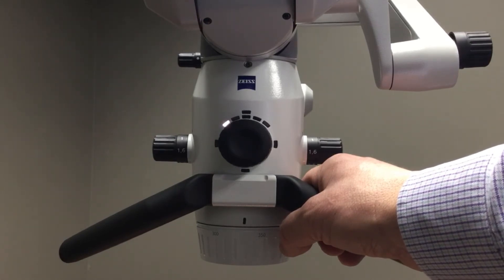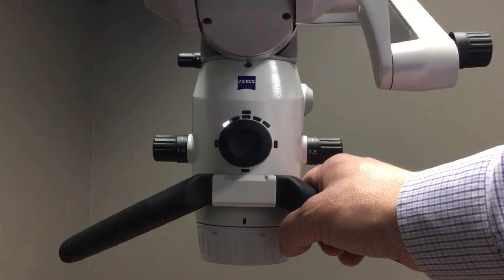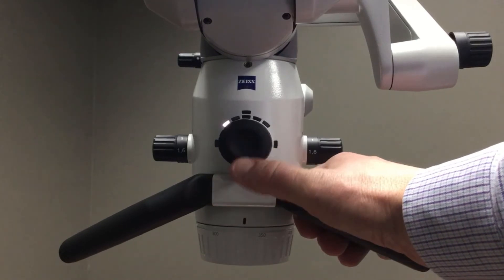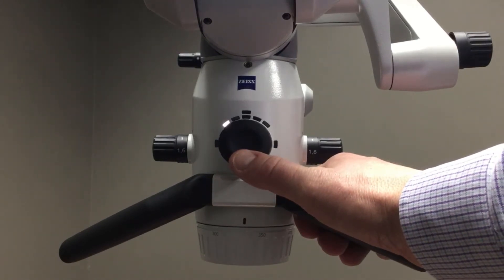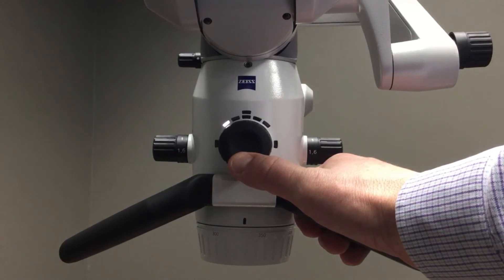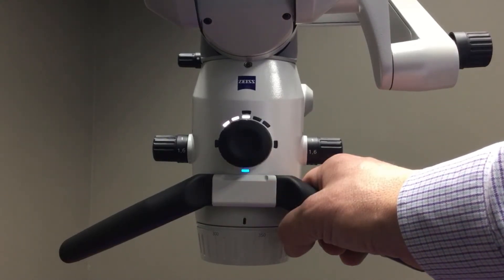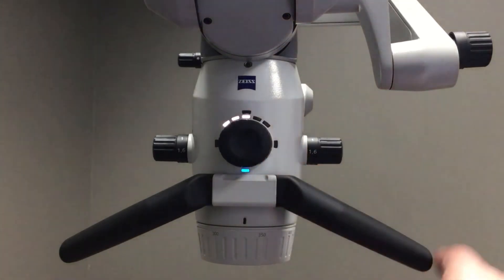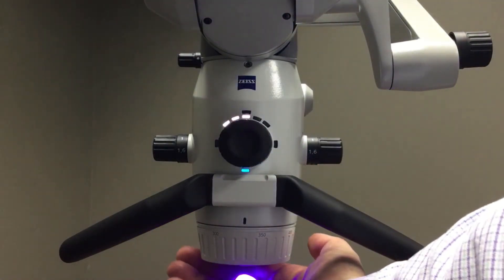Zeiss also has a series of optional technology packages that can be integrated into the microscope, and they're also able to be controlled by the wheel. When I tap in a six o'clock position, you'll see that a blue indicator light comes on — this is our fluorescence mode.